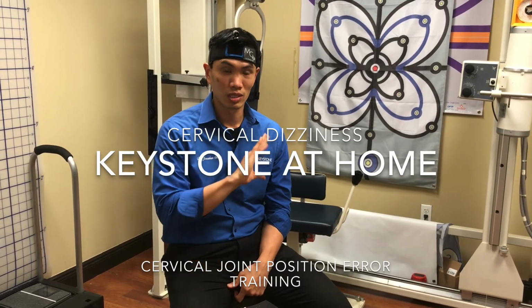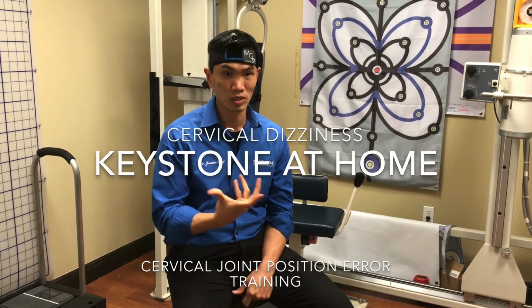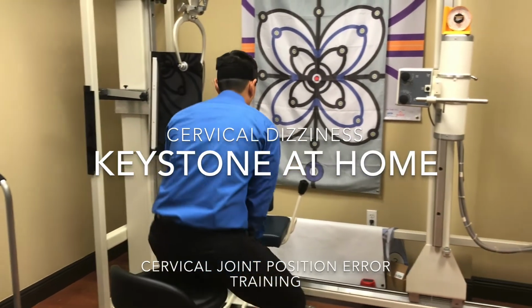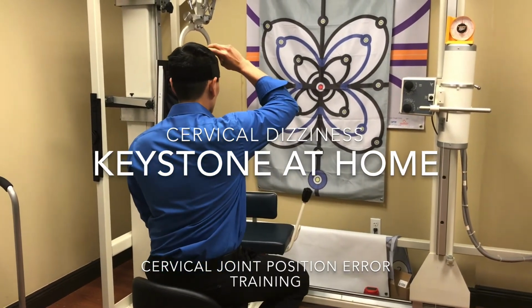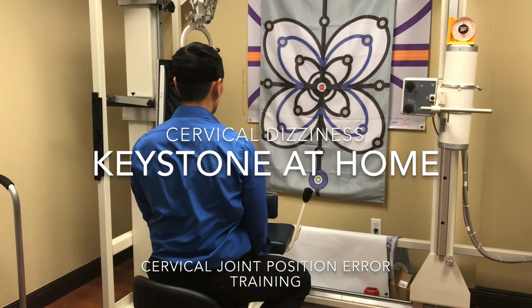So what we're going to do is a test called the cervical joint position error test, which we're also going to use as a therapy. The way you do it is you sit about 3 to 5 feet away from a target. You set yourself up so that the laser is hitting the target when you're sitting straight.